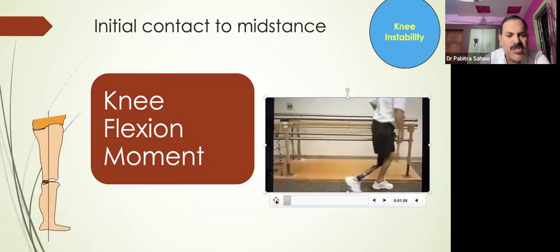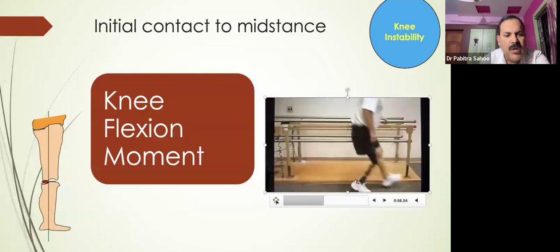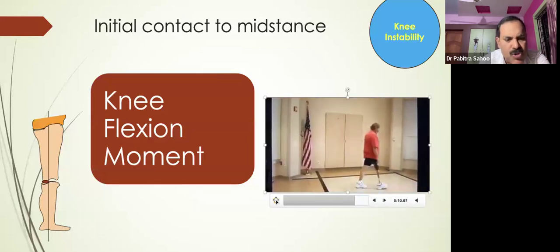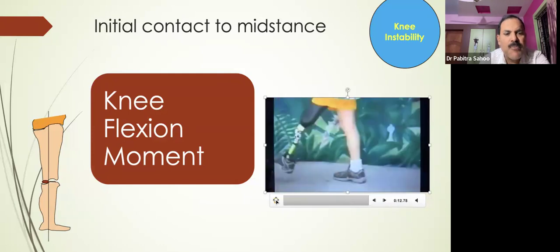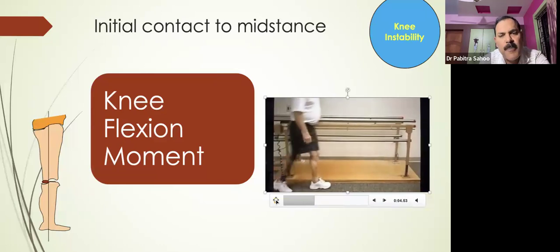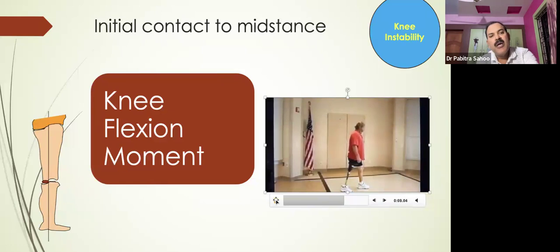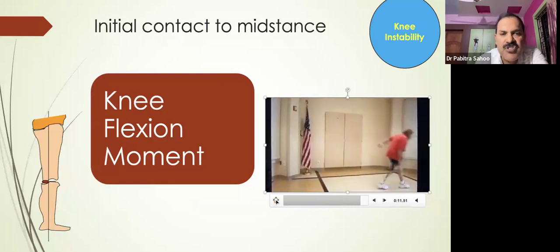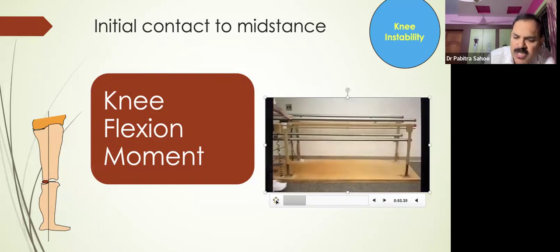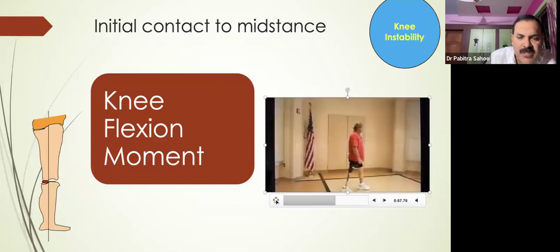So these things should be checked: the amount of hip flexion contracture, the power of the hip extensors, the type of heel cushion in the case of a prosthetic foot, and the position of the knee joint. All these four things should be looked for when you go for a gait evaluation of gait deviation seen from initial contact to the mid stance phase. I hope it is clear that the position of the knee joint gives the stability in the stance phase.